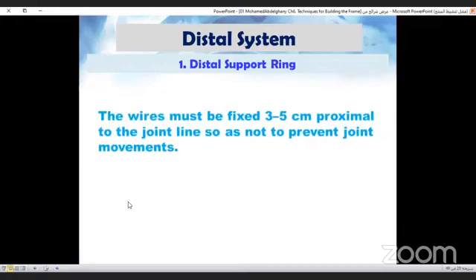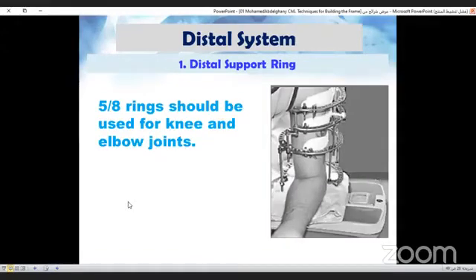The wires must be fixed three to five centimeters proximal to the joint line so as not to prevent joint movements. Near the knee and elbow, five-eighths rings should be used to allow free mobility.